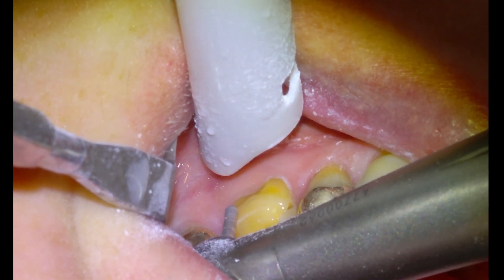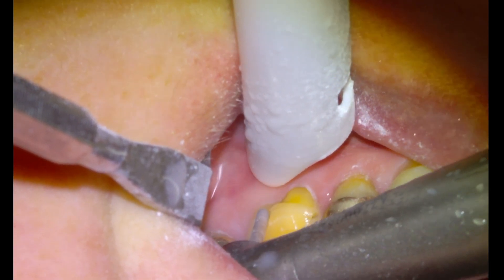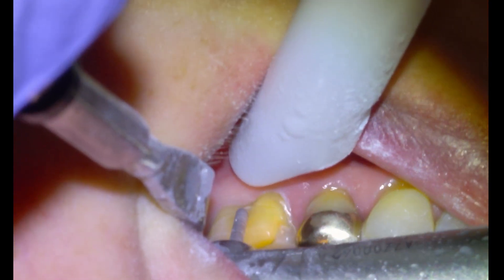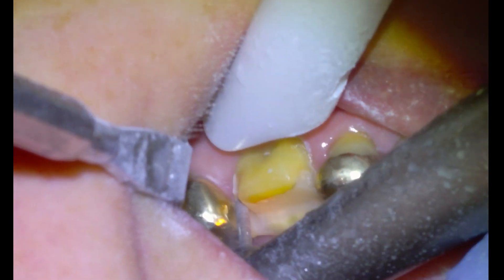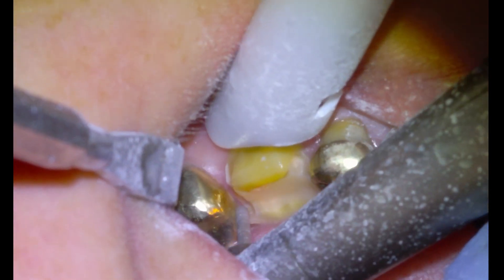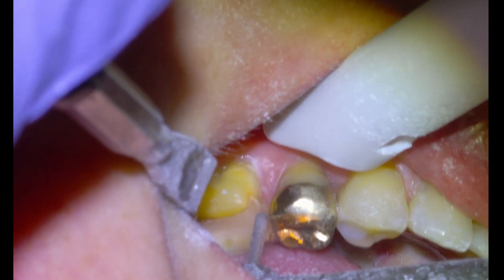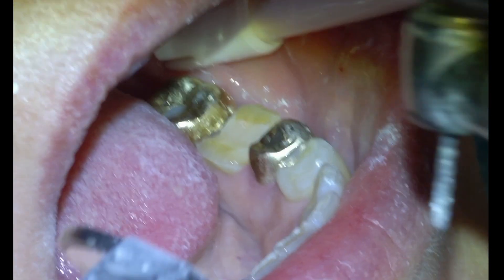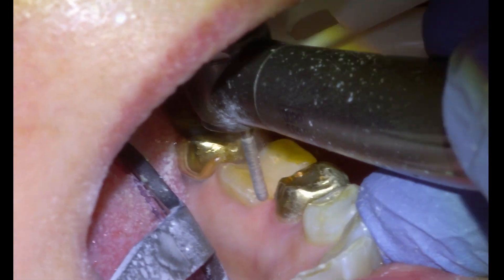We're going to start with our axial reduction on the buccal surface. It wasn't necessary to extend the margin down to the gum line, so we're going to leave it a couple millimeters supragingival on the buccal surface. Then we're going to do our interproximal reduction down to the gum line. We're working against two gold crowns so we'll probably scratch them here and there, but we'll polish them up before we scan. Then we're going to move back to nine o'clock and reduce the lingual axial surface of the tooth.